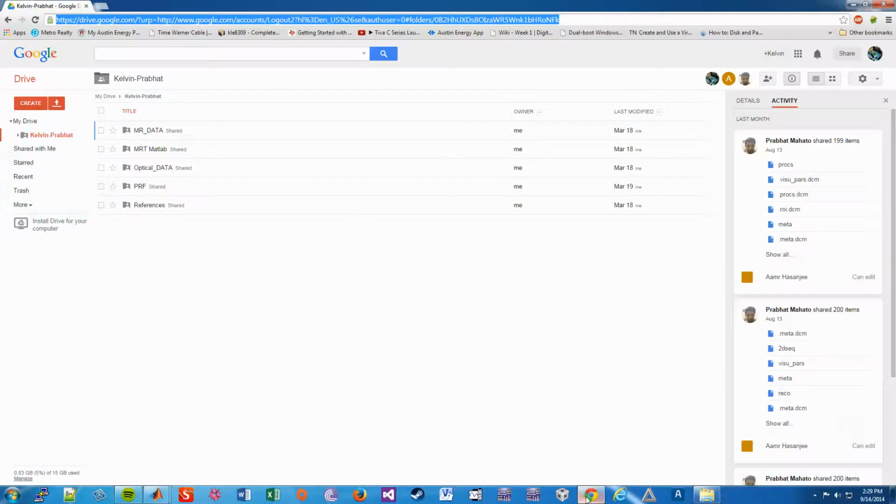Hello, welcome to a video tutorial series on proton resonance frequency. In this tutorial, you will need to have the following files.